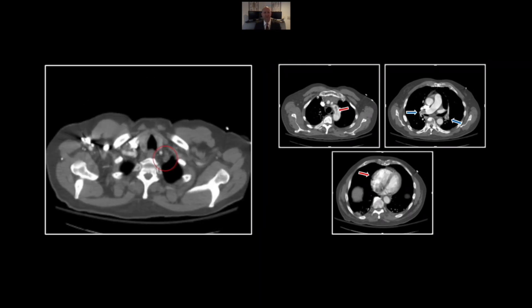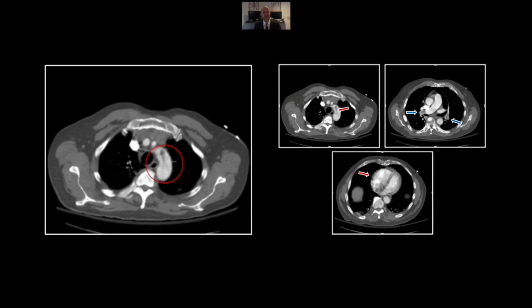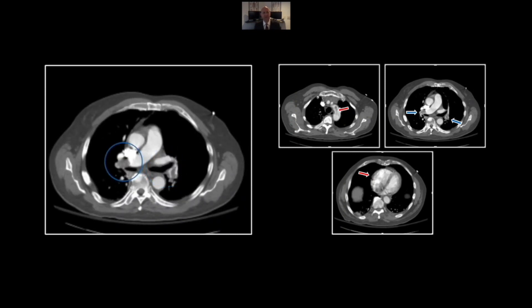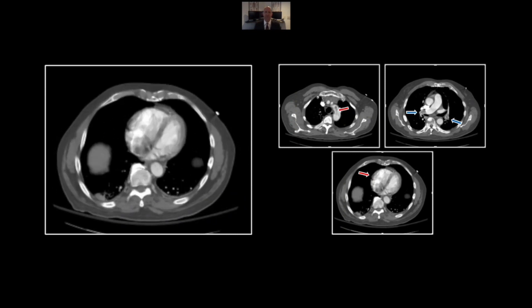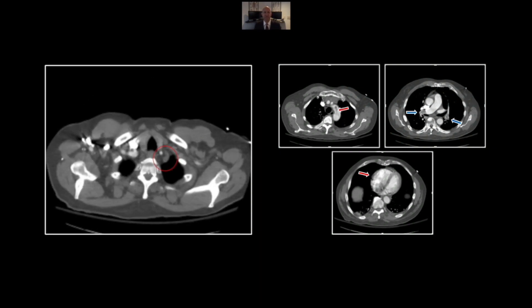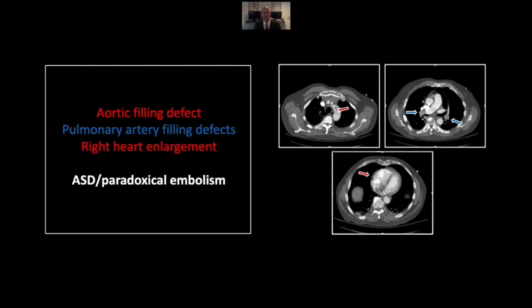The sequence of events is important here: there were bilateral pulmonary emboli, which resulted in a transient increase in right-sided heart pressures, causing a reversal of flow across this patient's ASD. That in turn resulted in the aortic clot. So that is an ASD with paradoxical embolism.